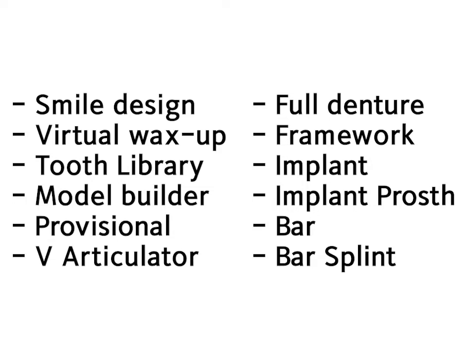The next one is the tooth library, which is also important to our class. Usually, design software would include a library of different forms of teeth that can be used across the different modules. These libraries can sometimes be expanded by incorporating additional anatomical forms from scanned teeth, which can be said as a novel innovation in the artificial intelligence era.